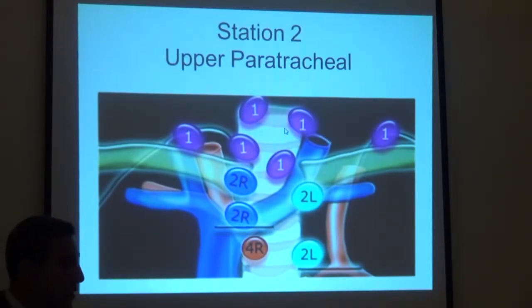You can, but it's a bit harder because it's a bit of a tilt. The bronchoscope is not very well supported. And it's easier to get to them from the neck. With regard to 2, so here you're on the left, you're above the aortic arch, and on the right, you're above the intersection of the left innominate vein and the trachea.